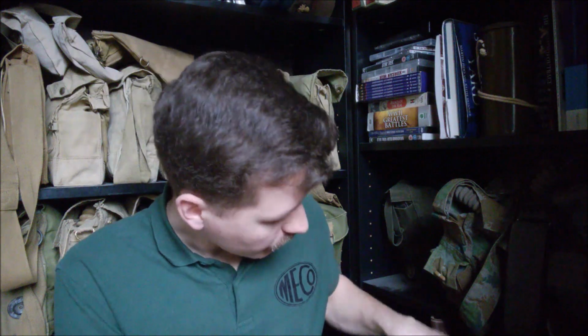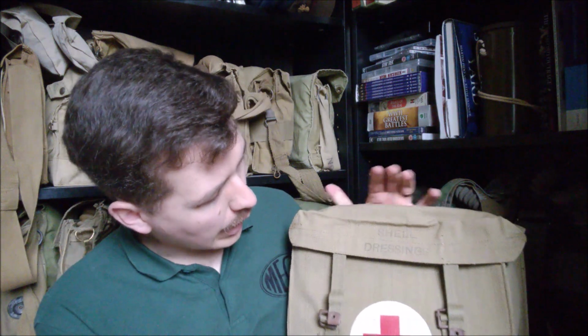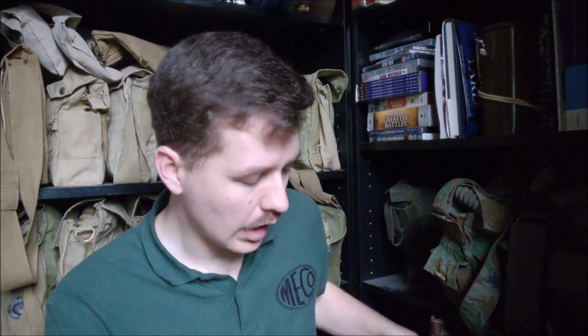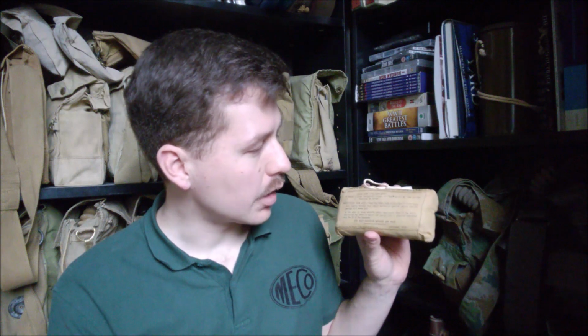They were also intended to be carried in these shell dressing bags, which I will do a video on at some point separately as well. But I believe the contents of this was 12 shell dressings, and these would be carried by medical personnel for immediate treatment of wounds. The whole point of the first field dressing and the shell dressing is to patch you up in order to get you to a medical aid station, the regimental aid post, and then back from there. So it's just literally put it over whatever's bleeding, get it on nice and tight, try and stem the bleeding as much as possible to get someone back to the regimental aid post.